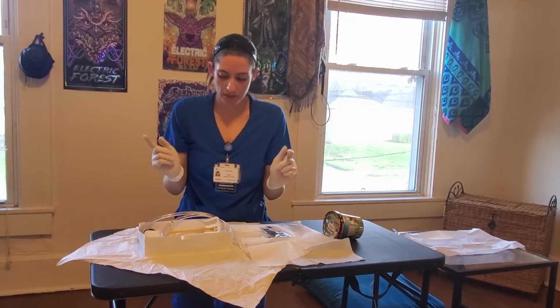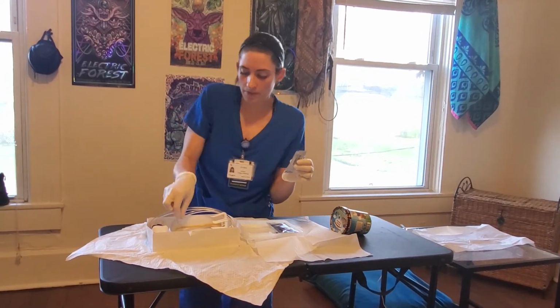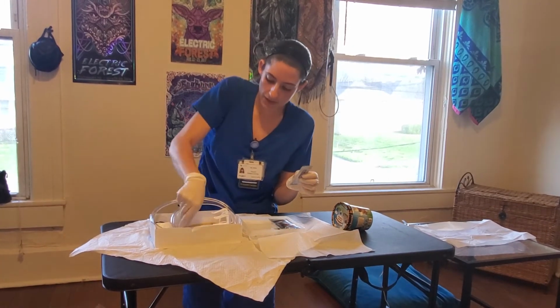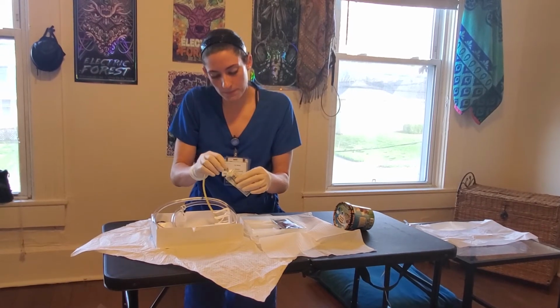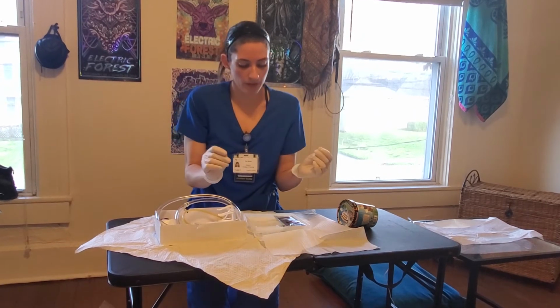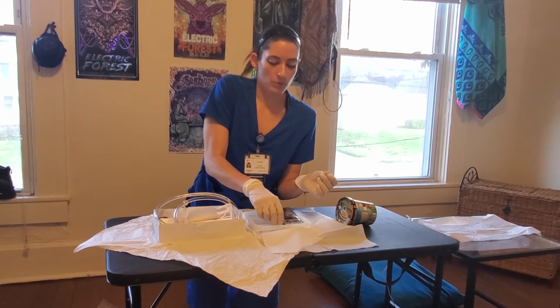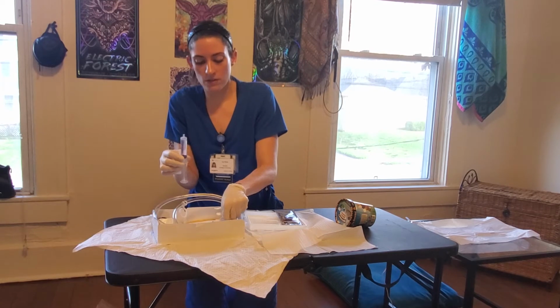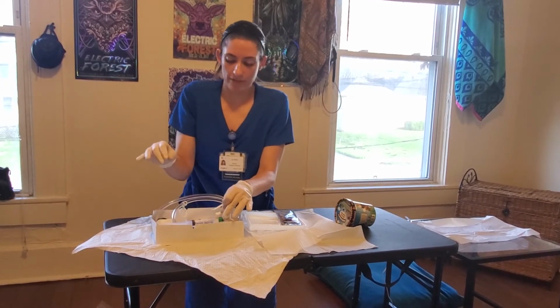I'm starting by preparing the catheter here. So for that we have our lubricant. We're going to take the end of the catheter that we'll be inserting and applying the lubricant to it. We're going to leave it in the tray. We're also going to go ahead and hook up the sterile water syringe to the port. And we can leave it in the tray.